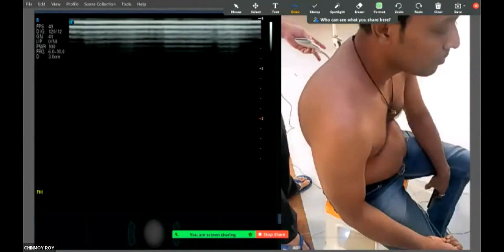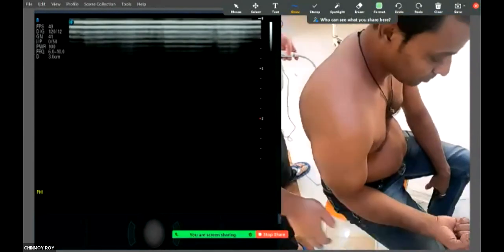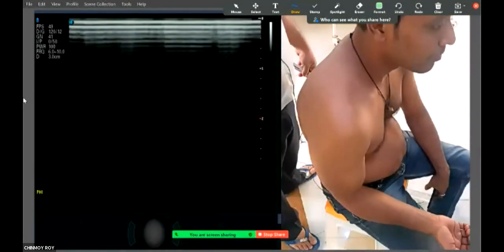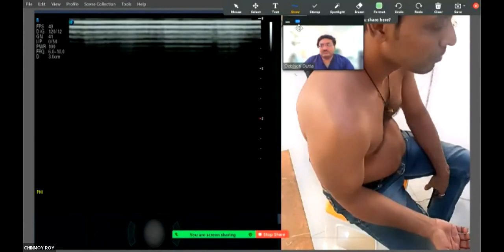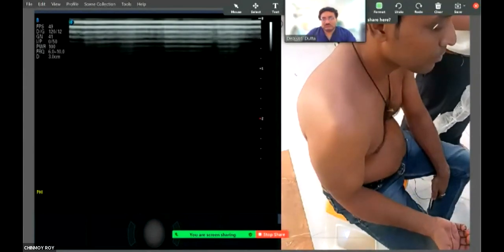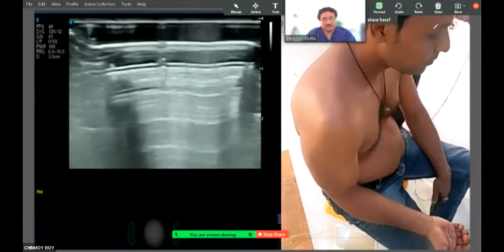Okay, so when we start doing ultrasound, we will start in a systematic manner, so that we do not lose our way. We do not go to a position where we do not understand where we are holding the probe. And for examining also, you should have one protocol in mind, so that you go to the right place.